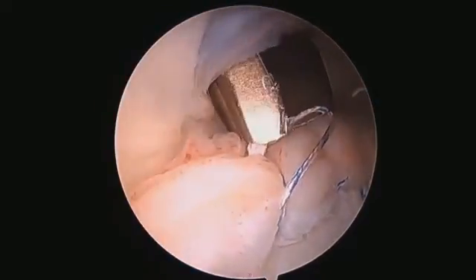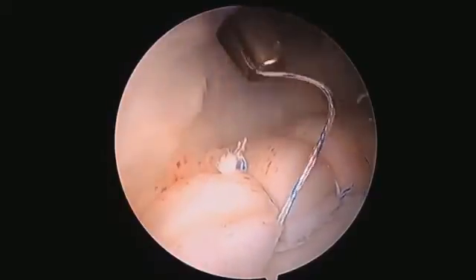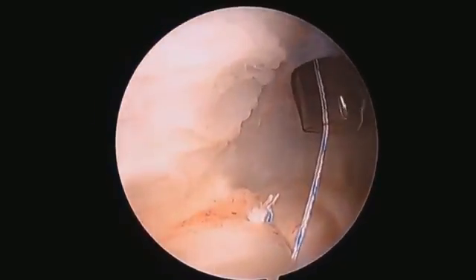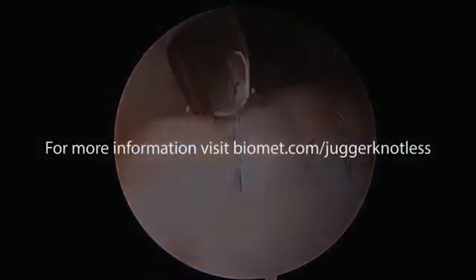The surgeon comes in and just trims it right away, both ends, and you're left with a series of these knotless anchors. That's what we're doing — just a little tiny bit like that.